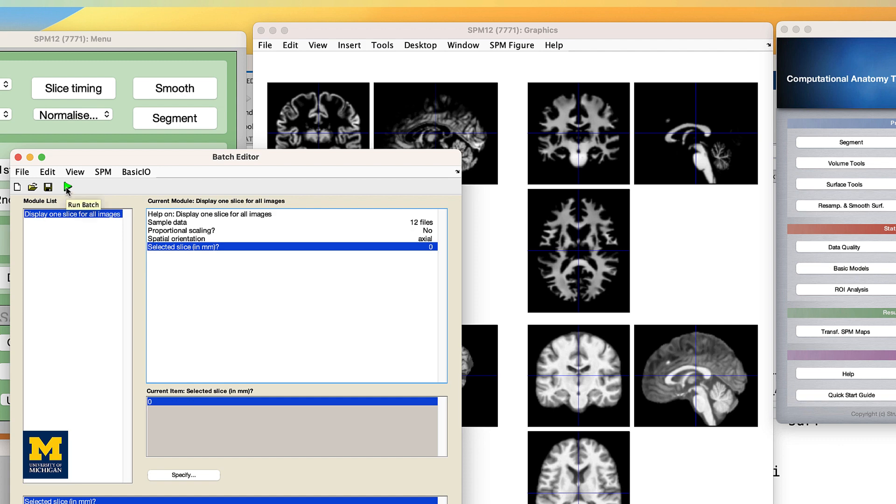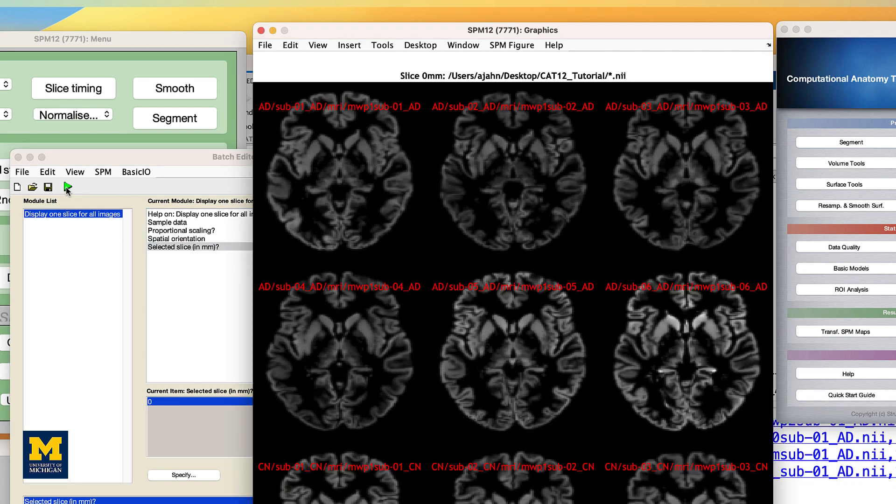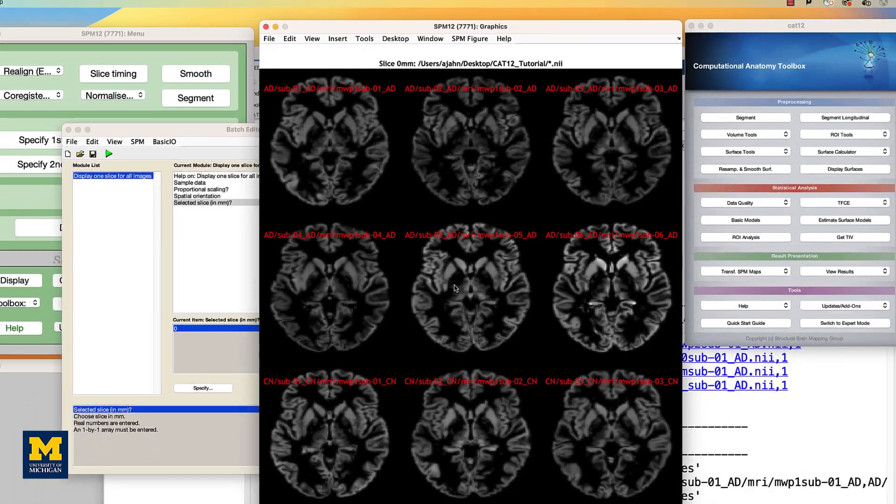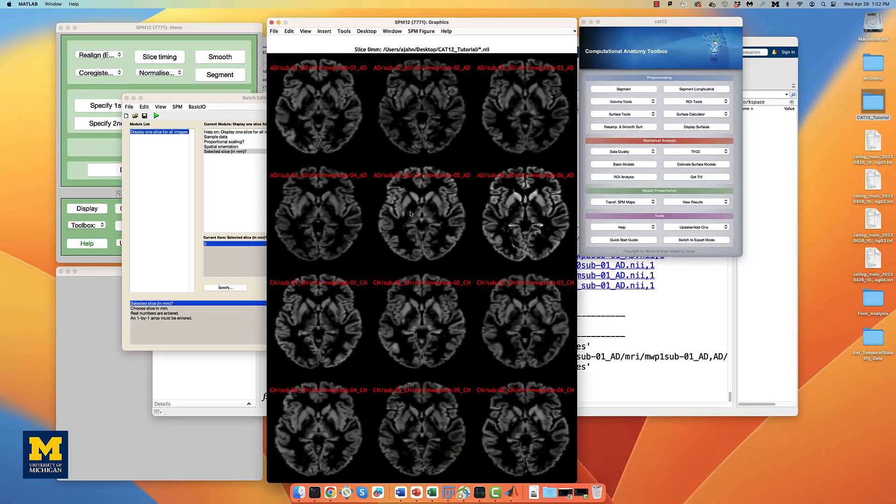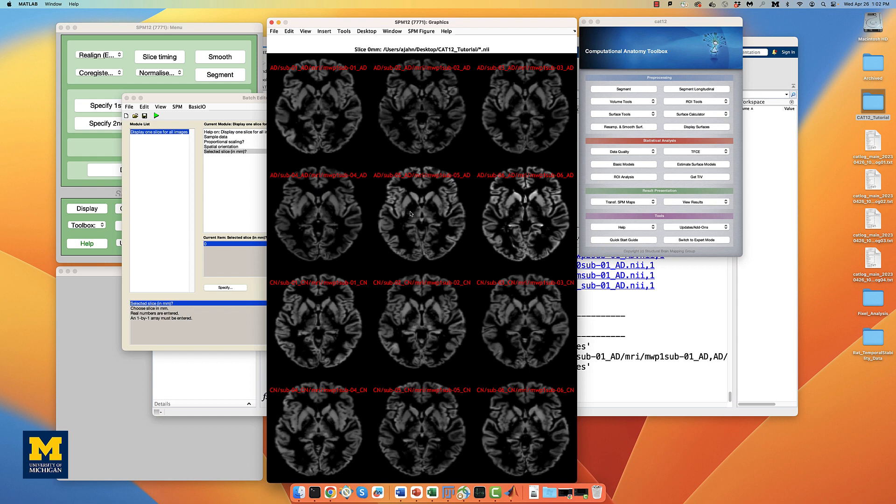Click the green go button, and observe whether any of the slices look significantly different from each other, either in orientation, segmentation, or slice number. If they all look roughly like they do in the following figure, you can assume that normalization has completed without any errors.